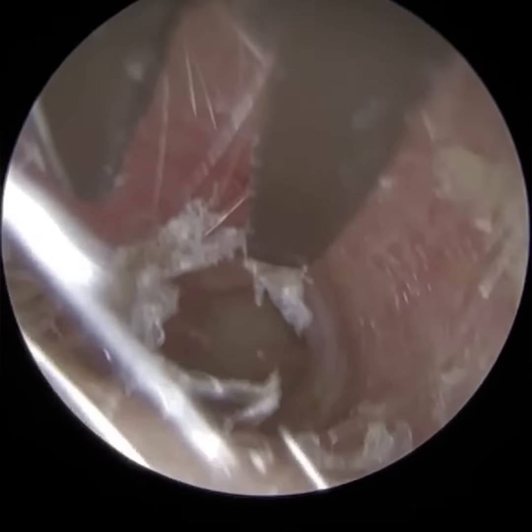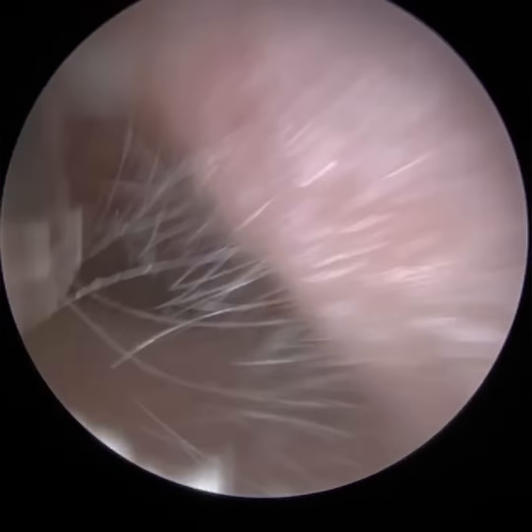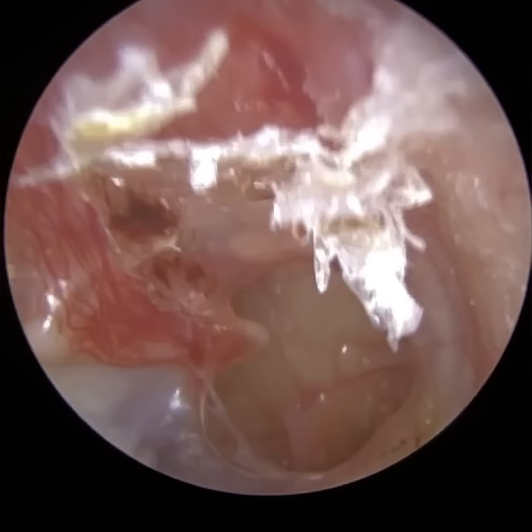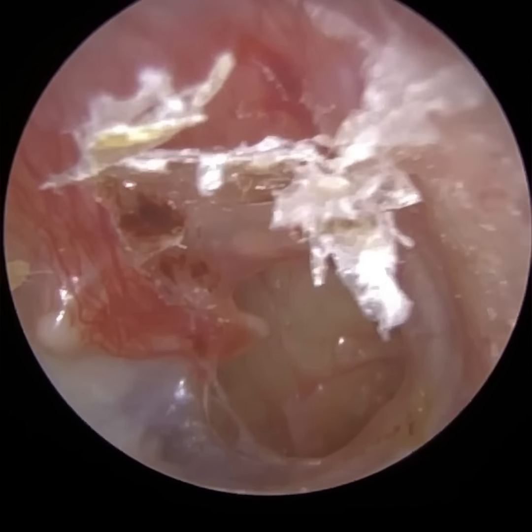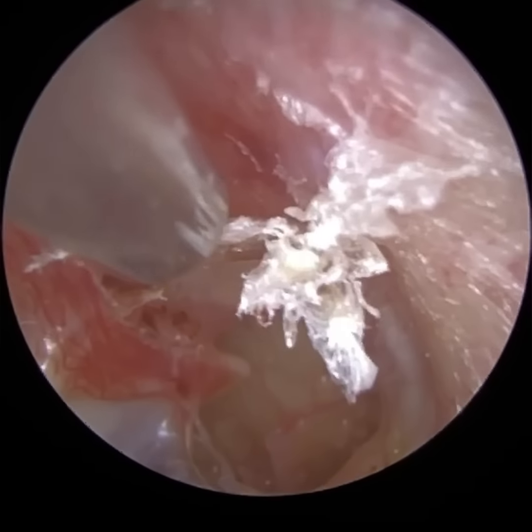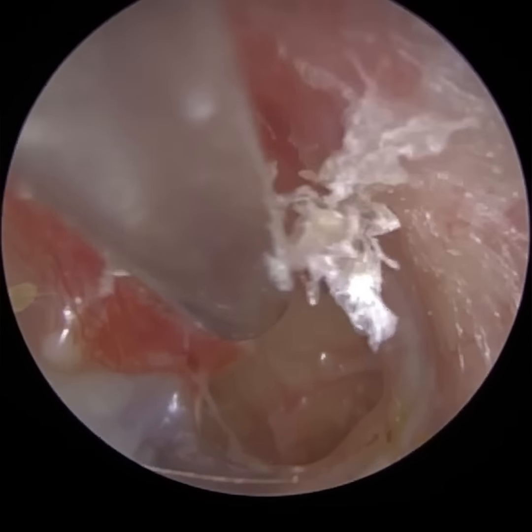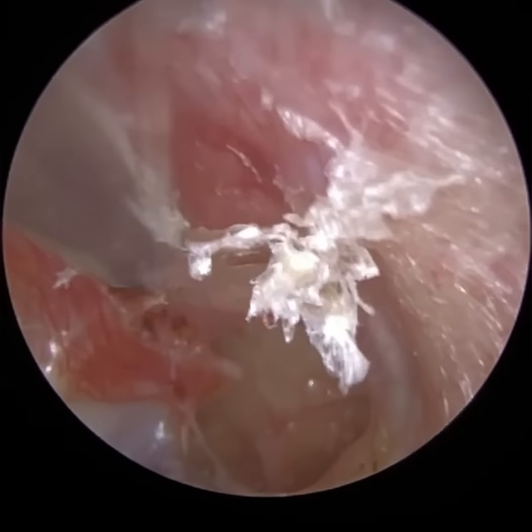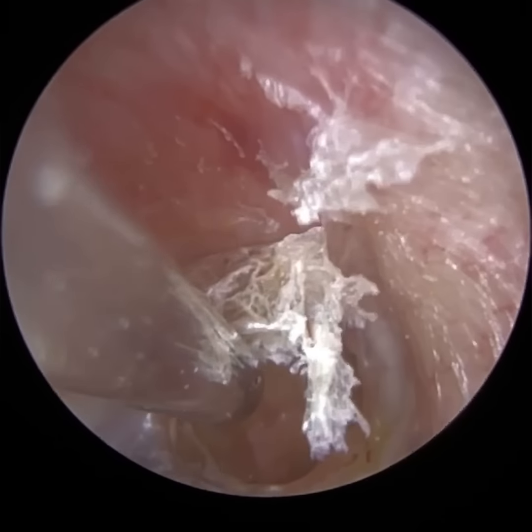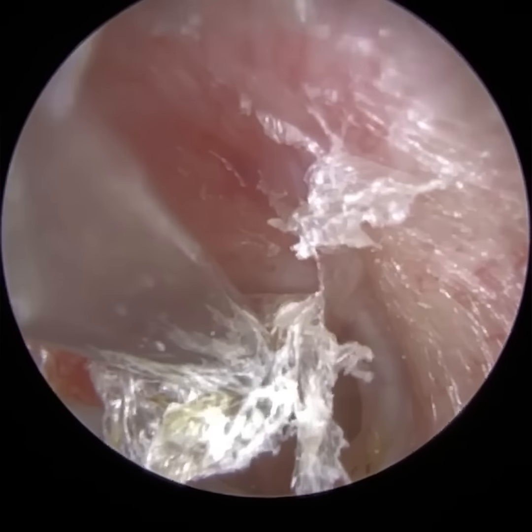Now, because you've got these waves of fluid, there's a secondary window called the round window, which we annotated earlier. And that's almost like a shock absorber. So when this fluid is traveling in the cochlea, the round window is a membrane and it's elastic. So as the waves are hitting the round window itself, it moves forwards to kind of absorb all that fluid pressure.